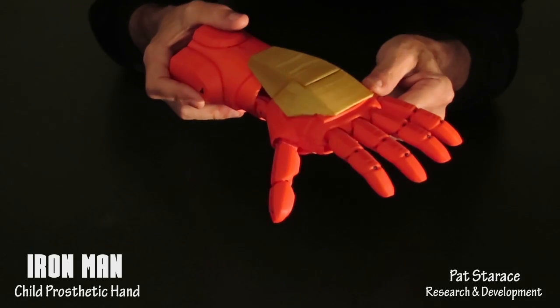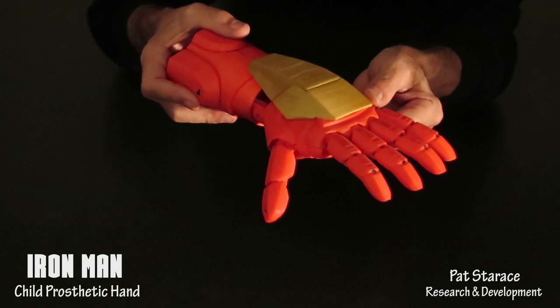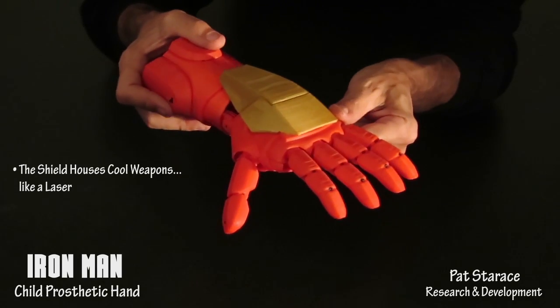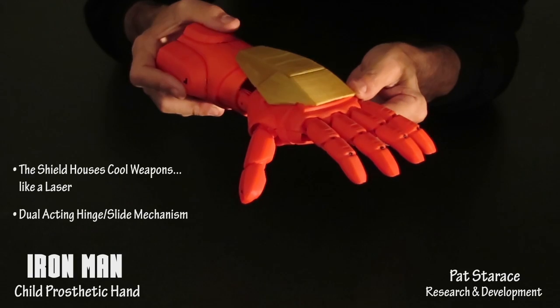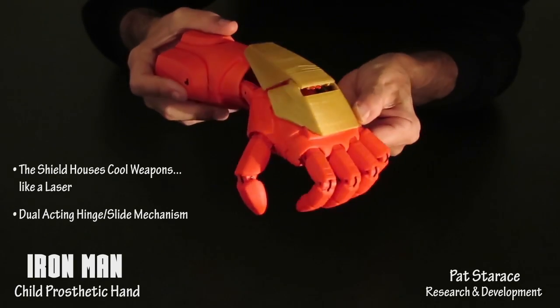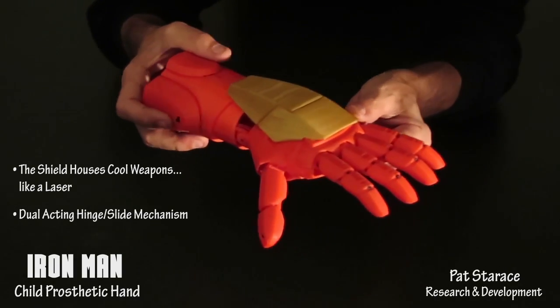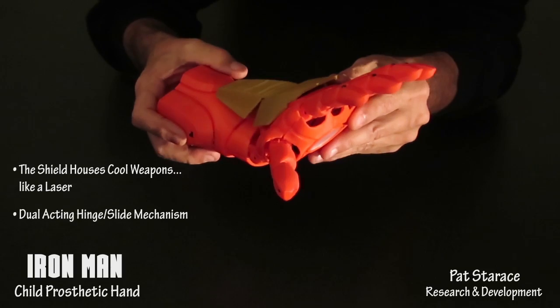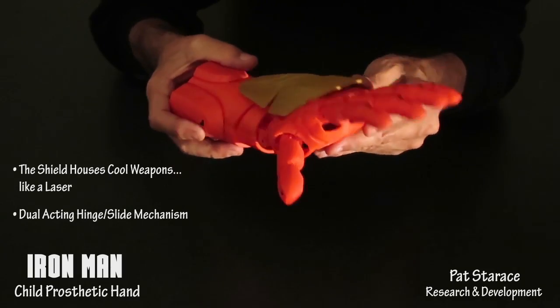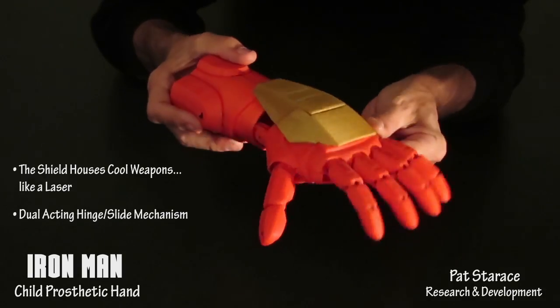The shield is another key characteristic of the Iron Man hand, and it also houses cool weapons like a laser. It has a dual acting hinge-slide mechanism — when you move the hand down, it hinges then slides, hinges then slides. It also hinges when the hand is tilted back, and when the two motions are done together, the mechanical movement is fascinating to watch.